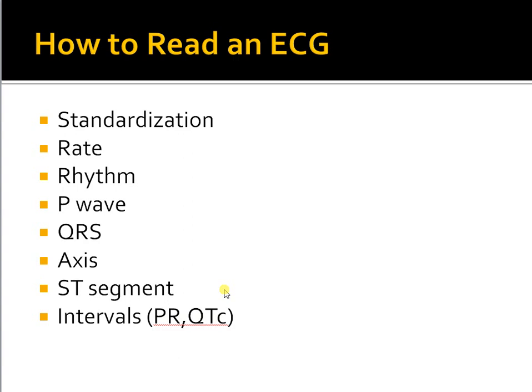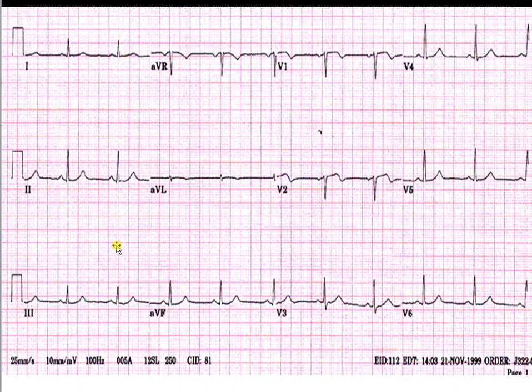Going to the basics of ECG reading, I'll go over some basic concepts and things that are absolutely needed — things one should never forget to comment on in an EKG or ECG. Looking at a normal ECG waveform, standardization is important, which is usually a rectangular bar you see on every ECG. Normally this should be 10 millimeters, and the speed is 25 millimeters per second. This matters for interpreting low voltage versus high voltage complexes.